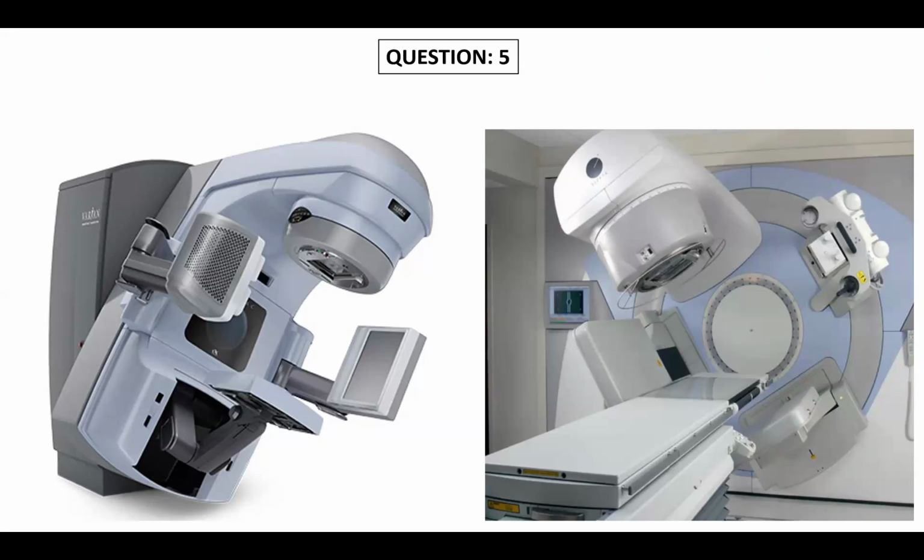Sir, we had a multi-leaf collimator, sir, which has a leaf thickness of 5 mm. This is a dynamic collimator, sir, which I had experience with. Throughout 40 centimeters, 5 mm is there, or only the middle 20 by 20 has 5 mm? All the leaves are 5 mm leaves. Sir, actually, when we joined initially it was there, sir. Later they dismantled it. I didn't have much experience with the basic one.